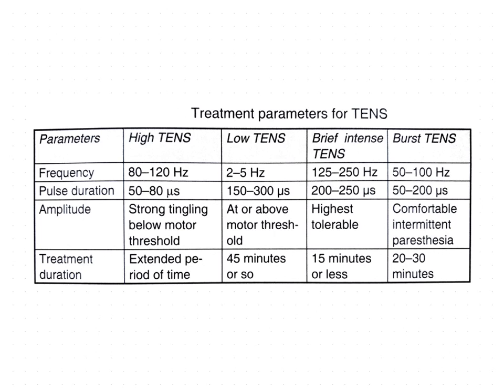Both acute and chronic pain can be treated with TENS. But quite often the patient's symptoms will dictate which pulse frequency is to be used. For example, a patient who has sustained an acute soft tissue injury of the shoulder may not respond favorably to low frequency TENS, which would cause pulsating contractions in the already traumatized muscle.